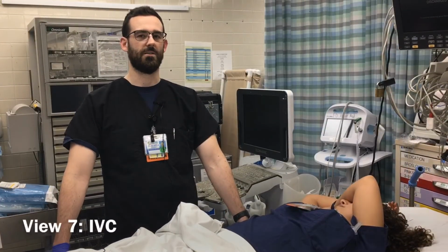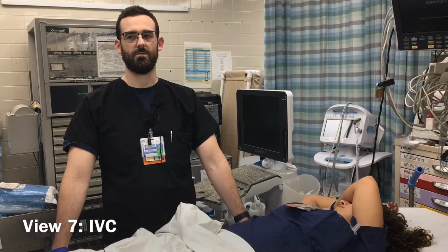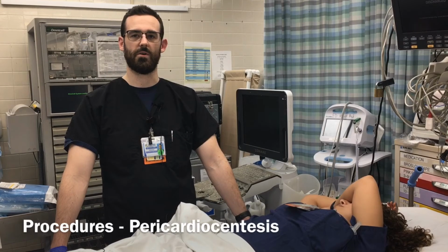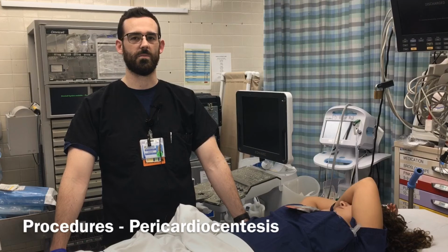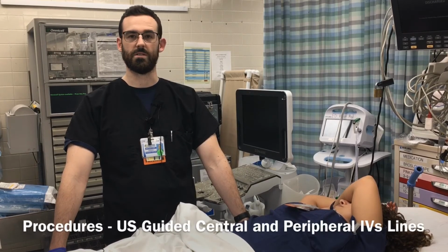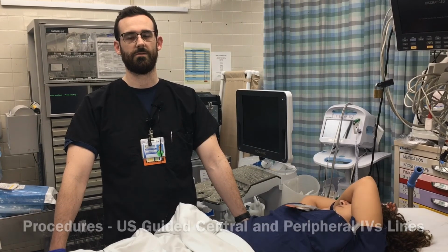Other uses for ultrasound in trauma are such things as looking at the IVC and using that to determine what type of shock the patient's in, where the most common shock in trauma is obviously hypovolemic. You can also use it for procedures, such as pericardiocentesis if you have a tamponade, making sure that your needle's in the right place and that you don't injure the myocardium itself during the procedure. You can also use it for ultrasound-guided central lines and peripheral lines if you're having difficulty during the trauma itself.